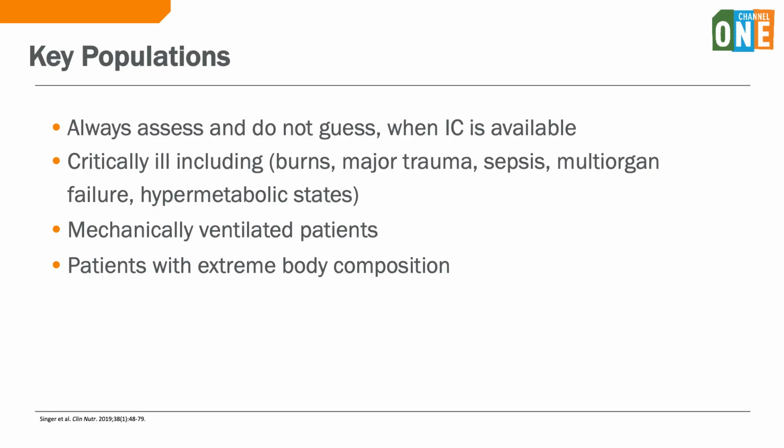Before testing, clinicians must evaluate patient safety, comfort, and equipment compatibility. Conditions that increase physical stress include agitation, fever, or ongoing procedures, which can compromise the accuracy of each test. Additionally, mechanical issues such as circuit leaks or incompatible ventilator modes can compromise the accuracy of the test. Identifying these issues early, prior to starting a test, ensures that the measurement is safe, feasible, and reliable.